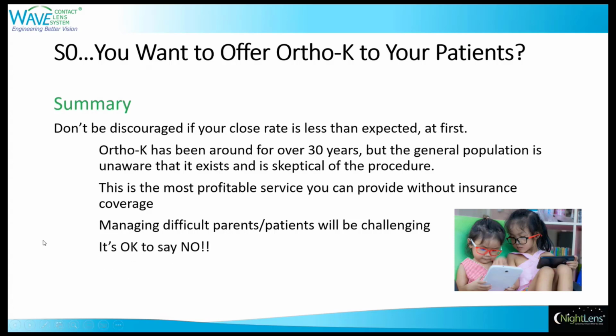And lastly, it's okay to say no. If you're just starting out and a patient in your waiting room has a very high prescription or has been wearing gas permeable lenses for 20 years, they take a brochure, and when you see them in your chair, they're going to hold this brochure up and say, I want these.